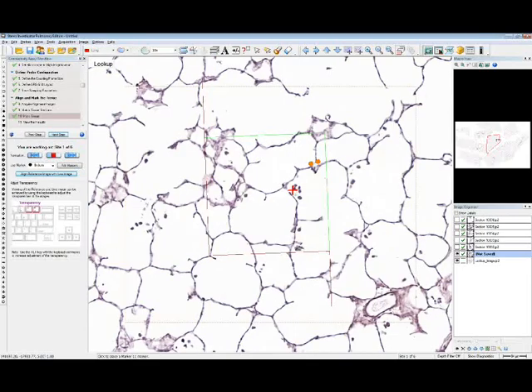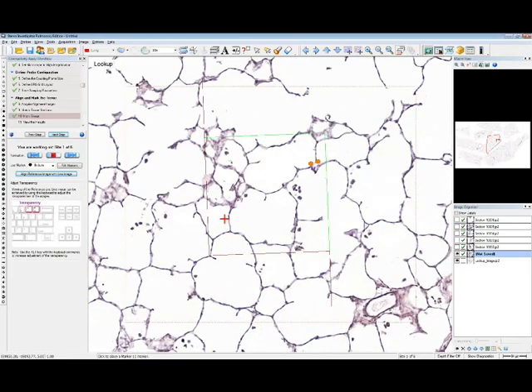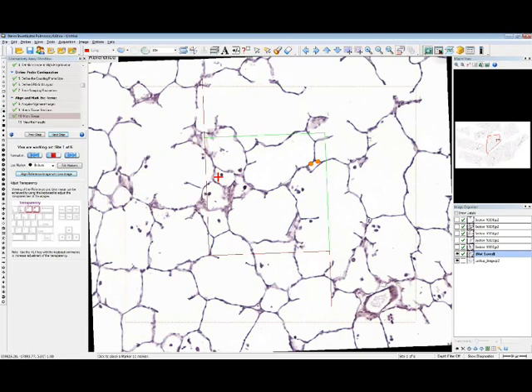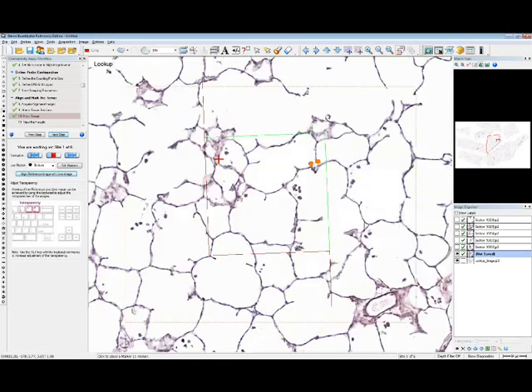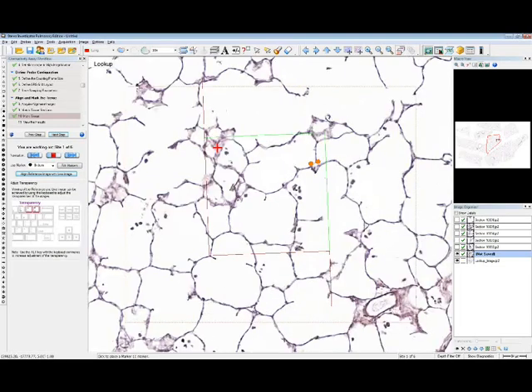Let's go through, and as I said, we probably all are looking at a different part of the system right now, but part of it is, that's why the dissector is pretty small, so we don't miss anything. So you want to go through and see if there are any other bridges to count. So again, this is the reference, that's the lookup, that's the reference. So we'll see.